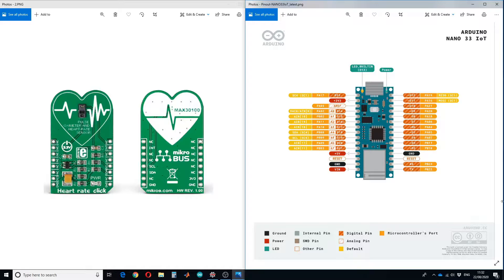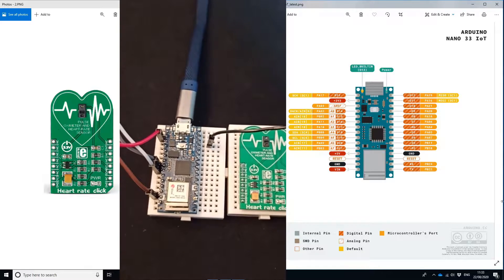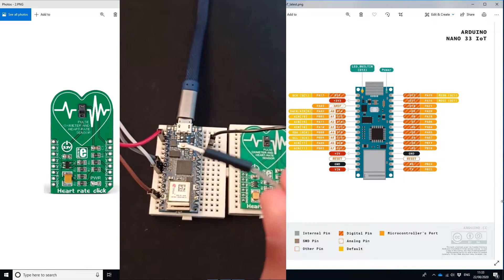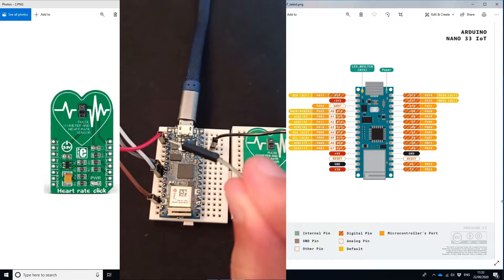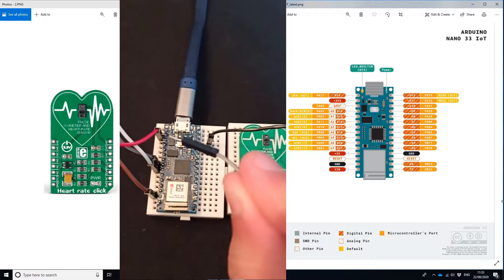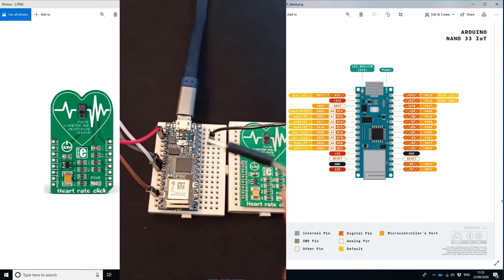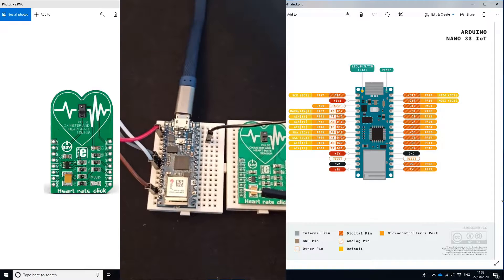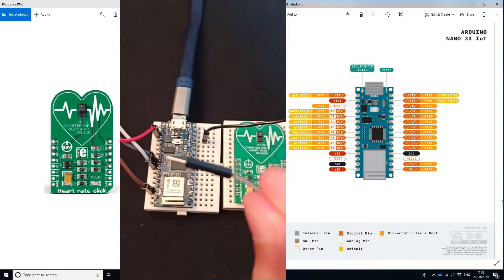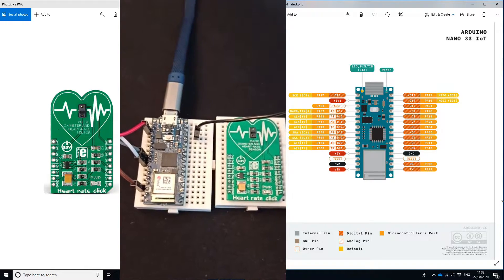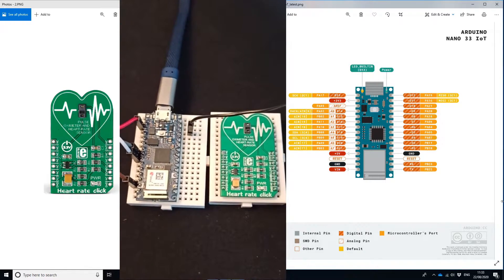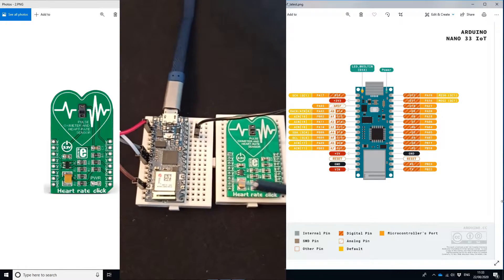The first step is to do wiring. You have to make five connections. Number one: the 3.3 volt pin of the IoT board will be connected to the 3.3 volt pin of the MAX30100 board.